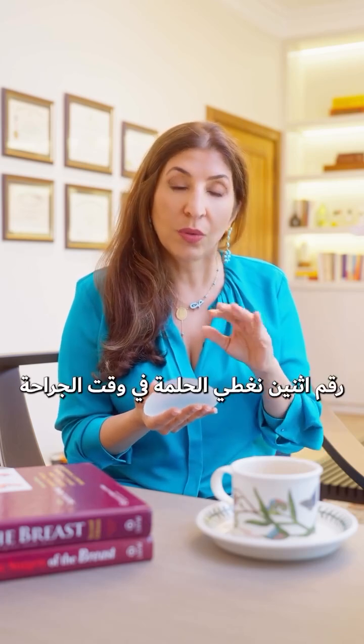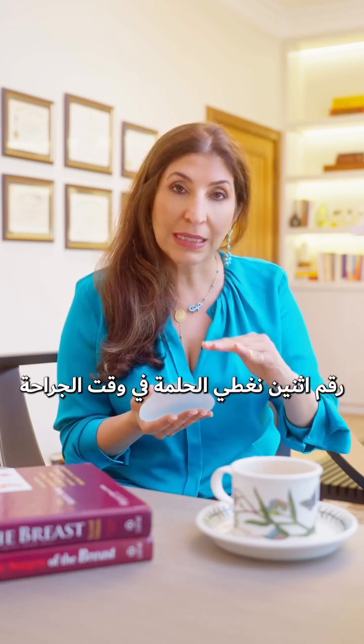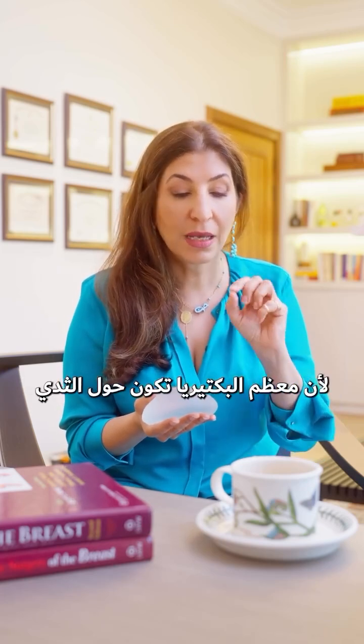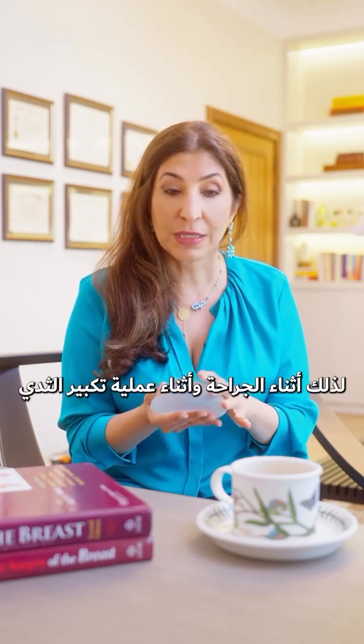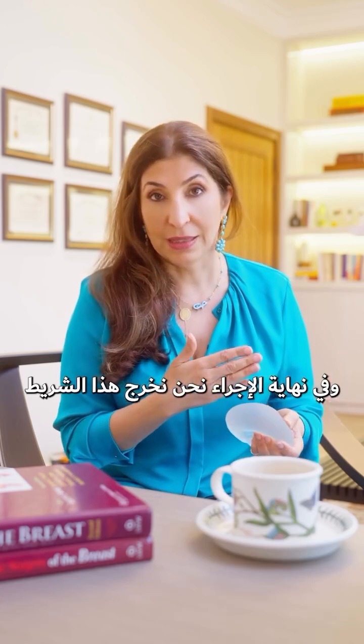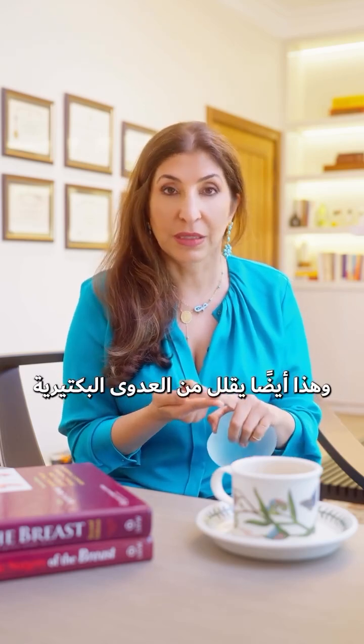Number 2, we cover the nipple at the time of surgery because most of the bacteria around the breast comes through the nipple ducts. So during surgery and during the breast augmentation procedure, we use a waterproof Tegaderm or tape that we place on the nipple. And at the end of the procedure, we take this out, and this also minimizes bacterial infection.